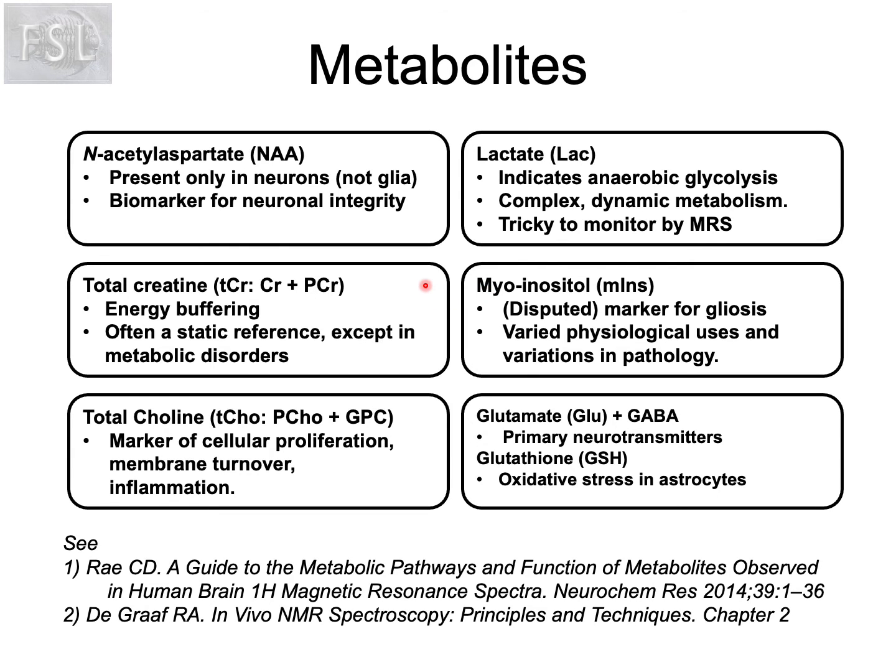Creatine and phosphocreatine, or total creatine, play a core role in the oxidative phosphorylation pathway, and by proton and phosphorus MRS we have a direct measure of that. However, the famous role of GABA and glutamate as synaptic neurotransmitters probably does not directly relate to the pools visible using MRS. And for the interested viewer, I direct you to these two resources for more information on this topic.